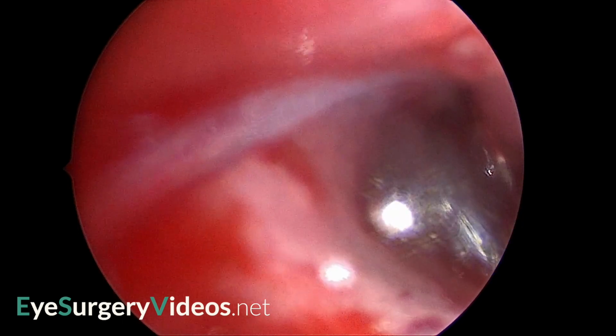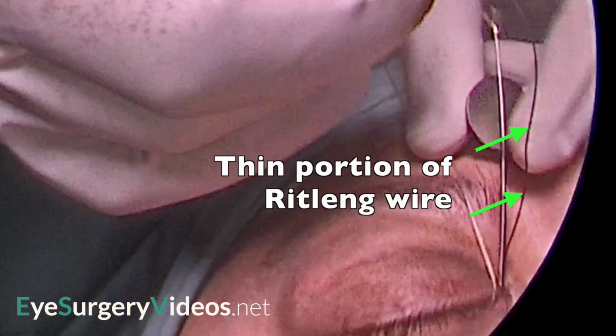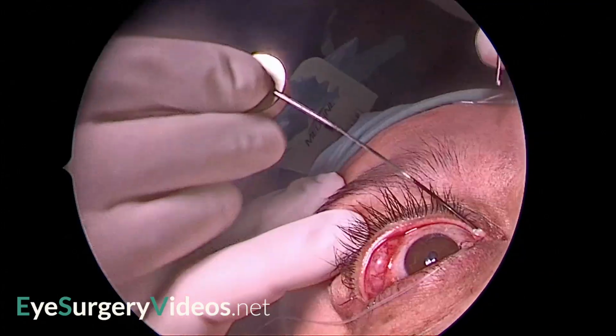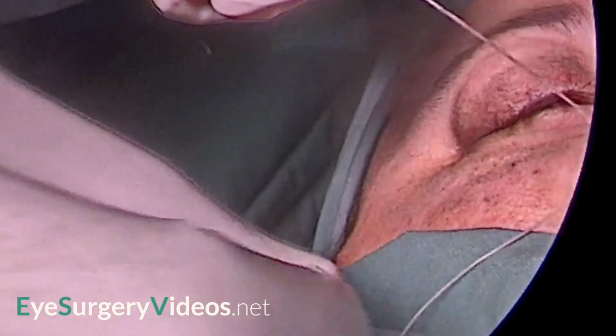As the stent wire is advanced, a thinner section of wire is reached, which is thin enough to slide out of the slit in the Ritleng introducer. The introducer can then be removed, leaving the stent in situ. The process is repeated through the superior punctum. The stent is advanced by pulling from the nasal end until the silicon section is in the nasolacrimal system.